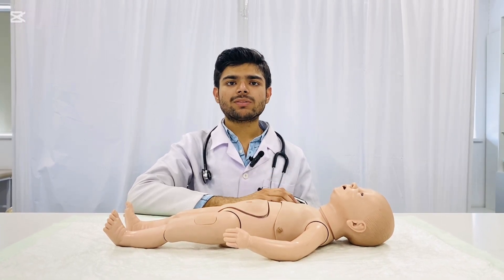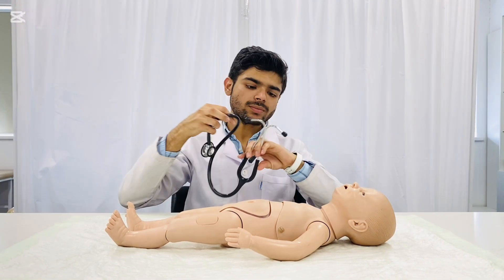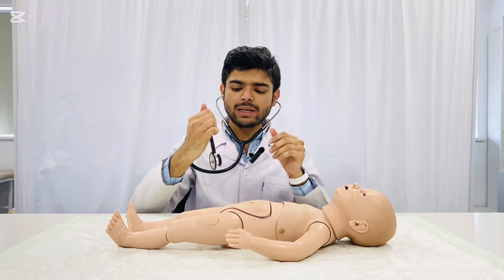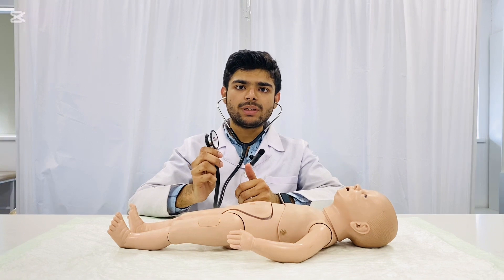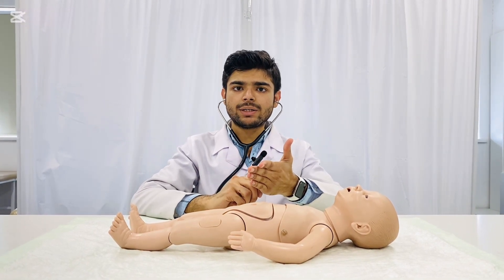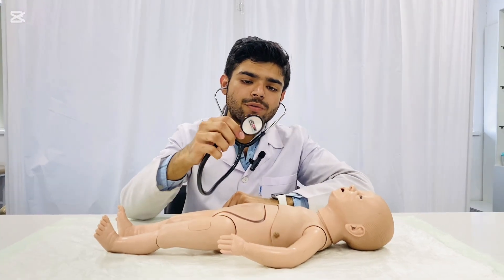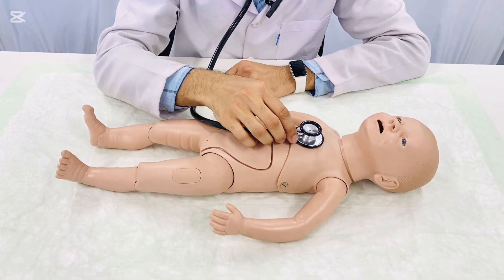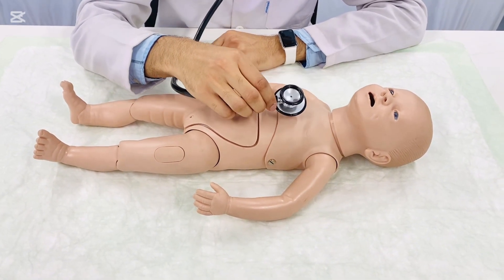Next, we will perform auscultation. For that, we will use a stethoscope. We will ensure that the diaphragm of the stethoscope is a little bit warm — we will rub the diaphragm on the palm of our hand to make it warm. We apply the diaphragm directly to the skin, not on any clothing on the baby or infant.